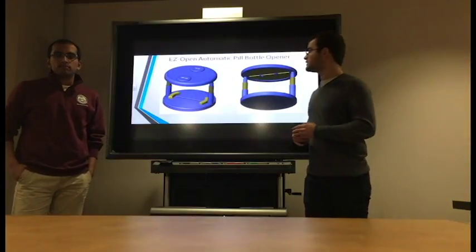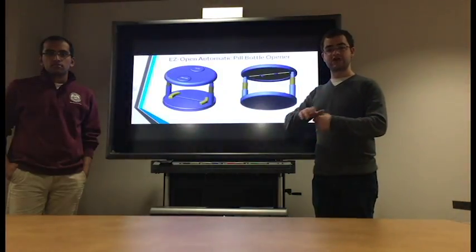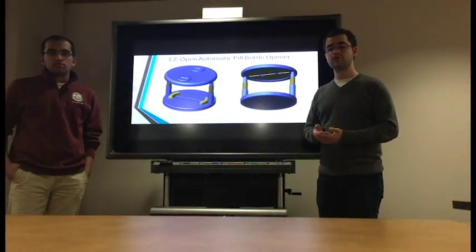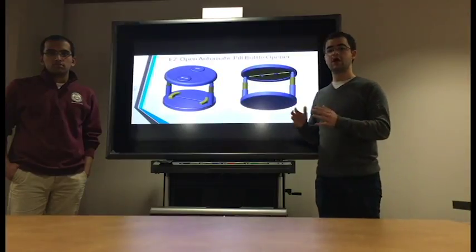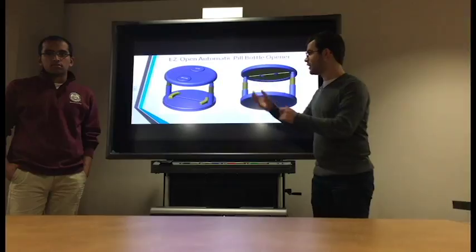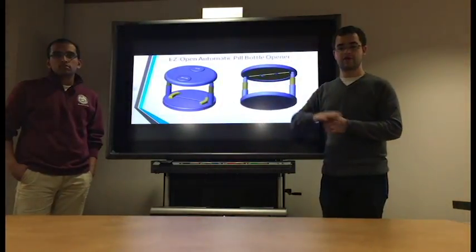The EasyOpen is electronically operated to apply the axial force and torque necessary to remove the cap from any child safety lock pill bottle. The bottle opener would remove the cap off of the bottle, leaving the bottle open here for the user to easily access their medicine.